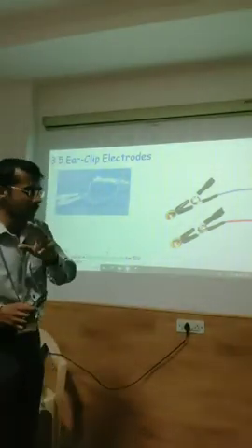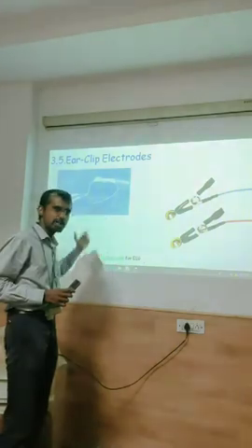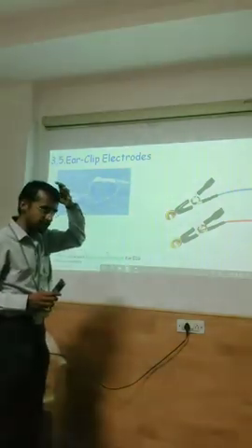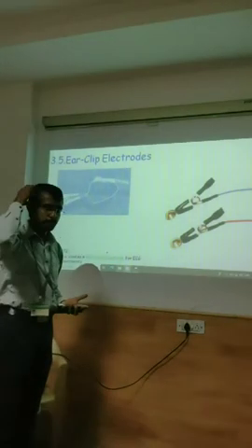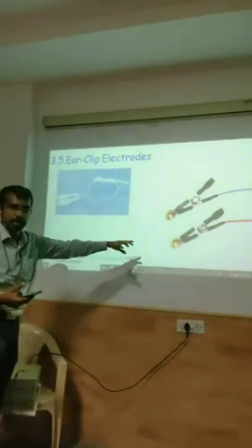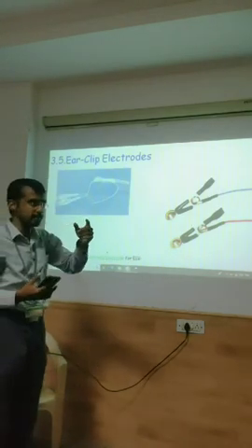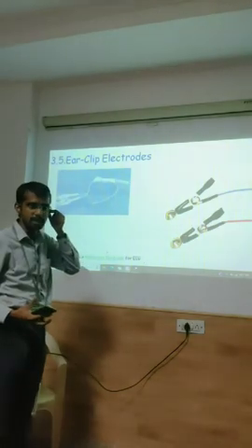So there are two electrodes or two lines: one is the signal line and the other one is the reference line. For example, in ECG, if we are trying to take signal lines in posterior regions... but it is mostly used in EEG, electroencephalogram, when they pick up a signal with reference to what they are trying to see. With reference, they will always go for an ear.